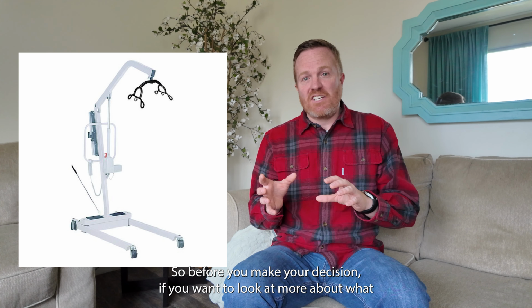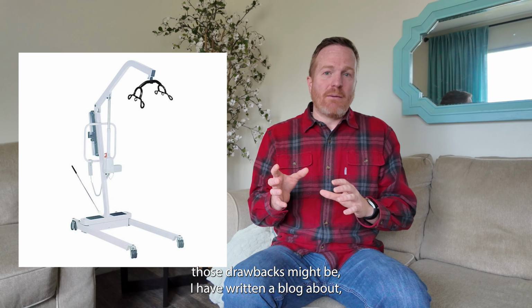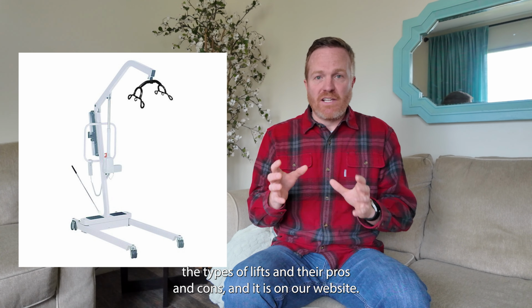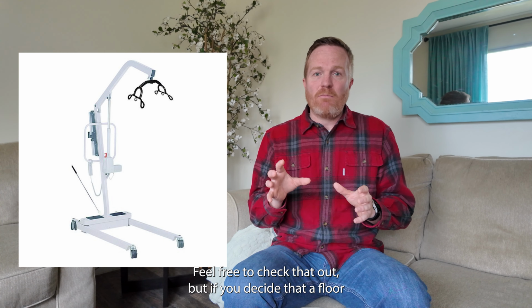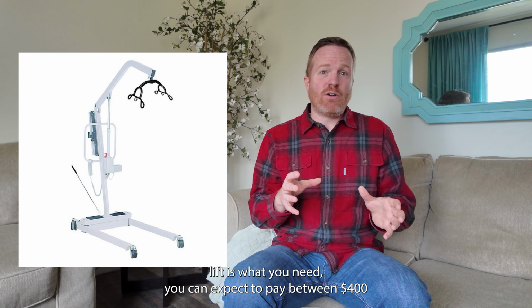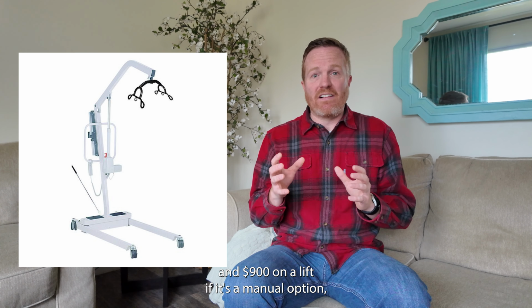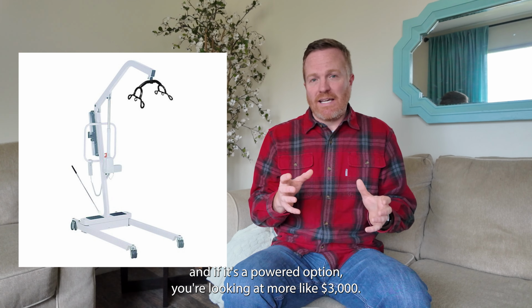So before you make your decision, if you want to look up more about what those drawbacks might be, I have written a blog about the types of lifts and their pros and cons, and it is on our website. Feel free to check that out. But if you decide that a floor lift is what you need, you can expect to pay between $400 and $900 on the lift if it's a manual option. And if it's a powered option, you're looking at more like $3,000.